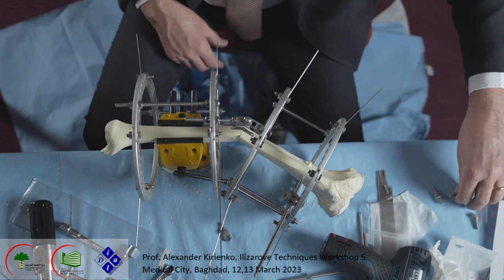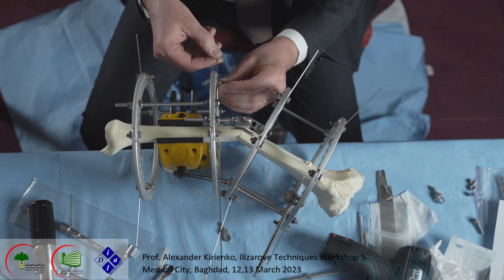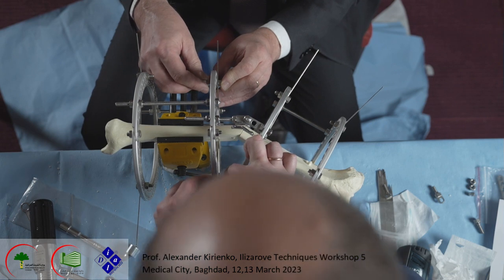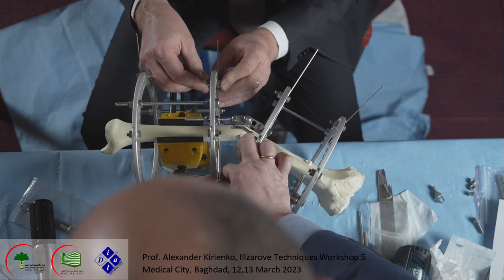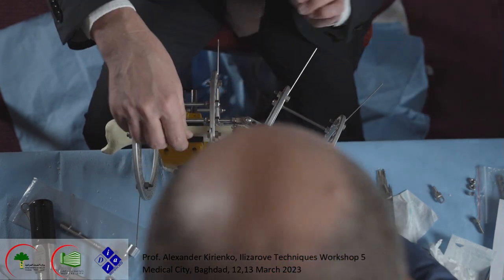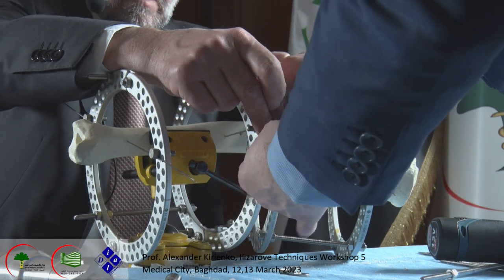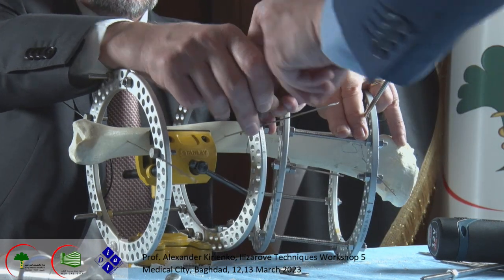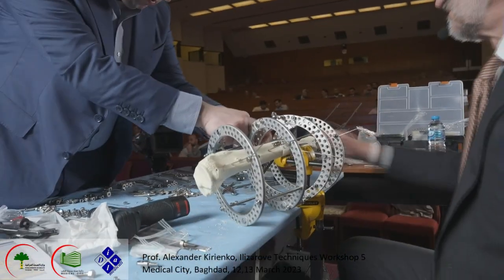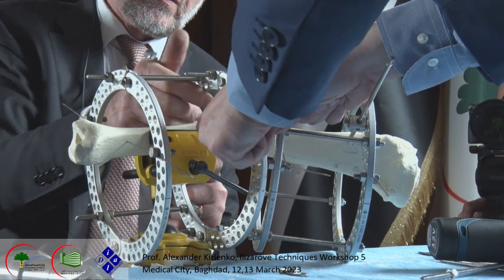Okay, I've fixed this half with this wire. Okay, I tied this.